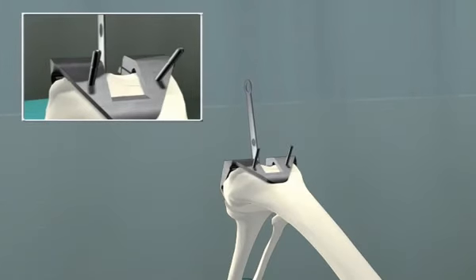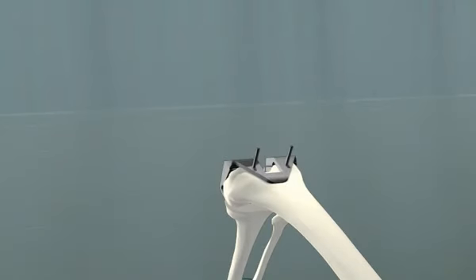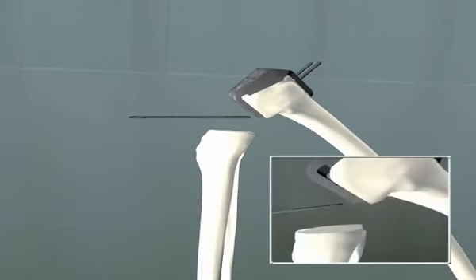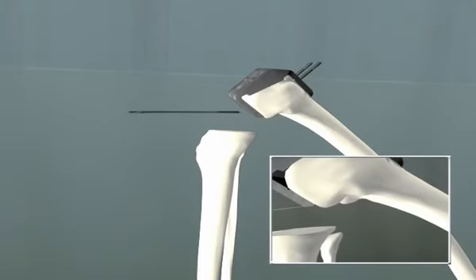The anterior intercondylar cut is then outlined with a power saw medially and laterally in its slot. The bone is then removed using an osteotome from either the inferior or superior surface. The posterior condylar cut can then be made with a power saw or osteotome, making sure to remove the posterior bony contents that will prevent impingement into the bearing surfaces.